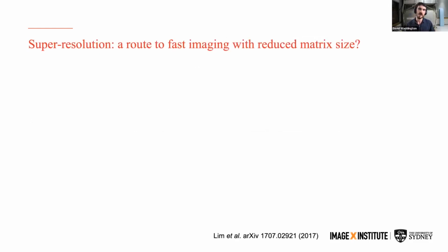But as for our MRI LINAC application here, we want to increase this imaging speed. We want to see how fast we can image, how fast we can track, and with what boost our spatiotemporal resolution. So one of the things to really speed up MRI is to reduce matrix size. We can do that easily on an acquisition side on an MRI scanner, but then we've lost resolution. So super resolution is an AI technique that allows us to artificially generate resolution.